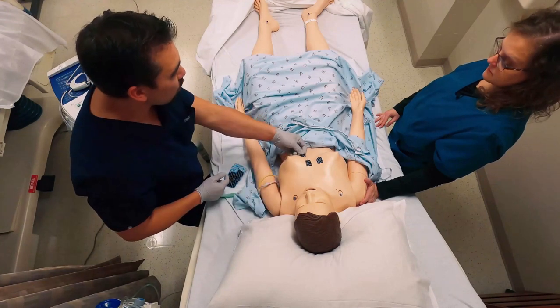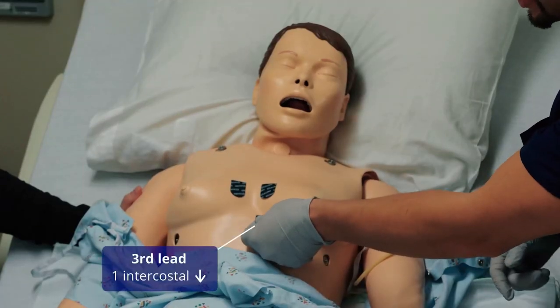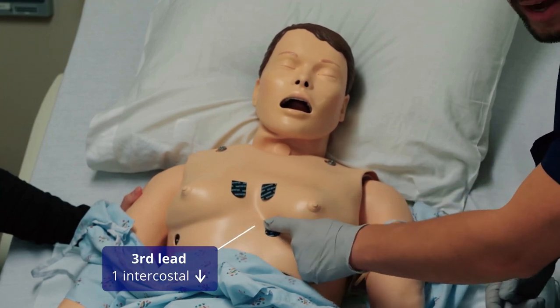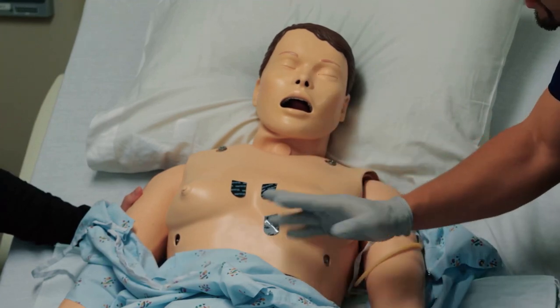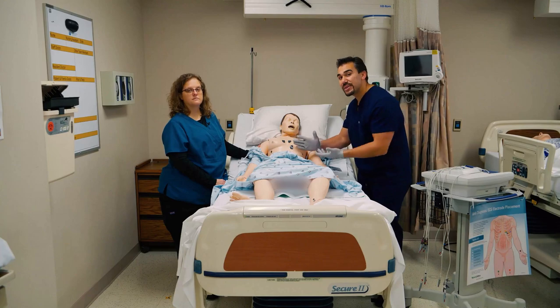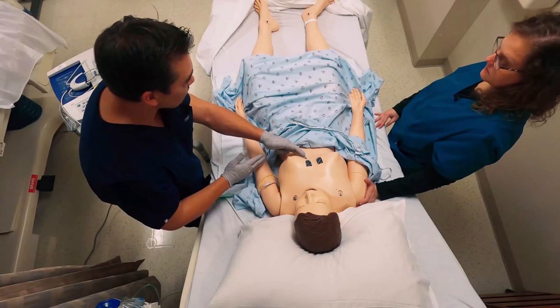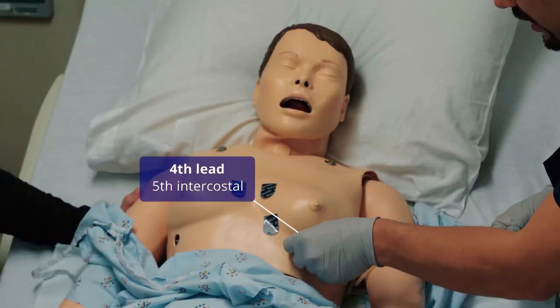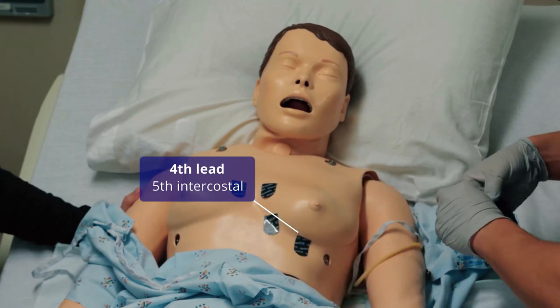Then we go one intercostal space down for lead number three. Sometimes you'll see EKG techs place it slightly differently, but right here in intercostal space number five is the ideal goal. For a female patient, we want to go as much as possible underneath the adipose tissue to get really good skin contact and capture those electrical waves. Then we do the same thing with lead four, staying in the fifth intercostal space.